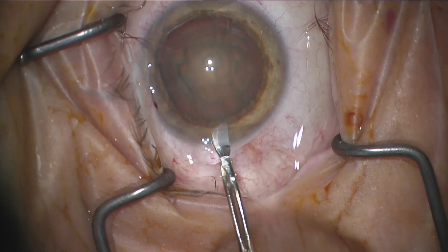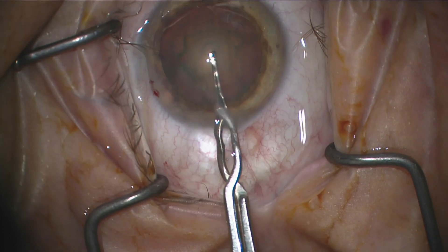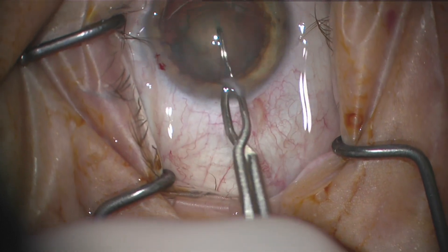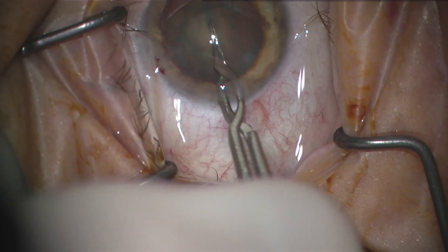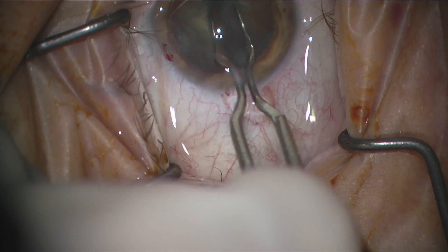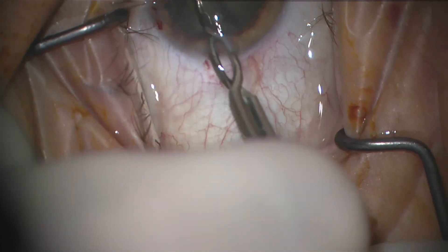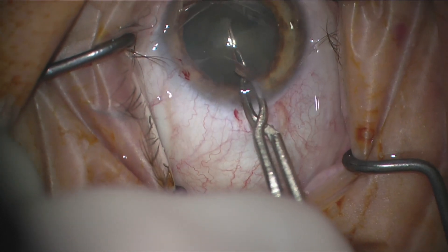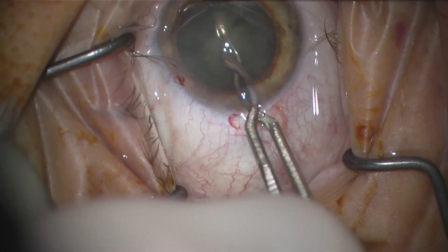This is better used on softer lenses — lenses that are basically pre-choppable like what I'm doing right here. Now this lens turns out to be a pretty thickened one; I would call it at least a 2.5, maybe almost even a 3+ Brunessen nuclear sclerosis. So I was having a little difficulty with pre-chopping it but I just spent a little extra time to make sure I could do so.